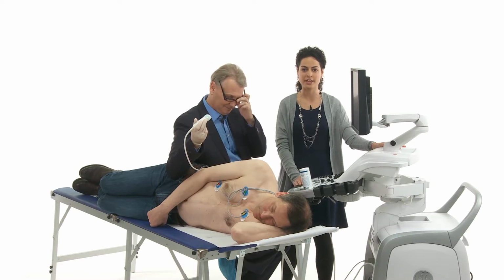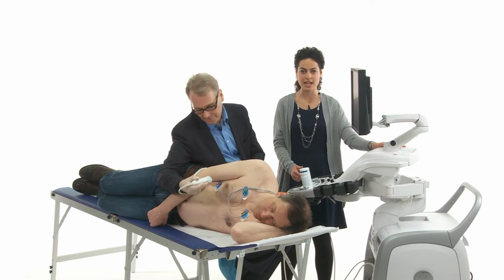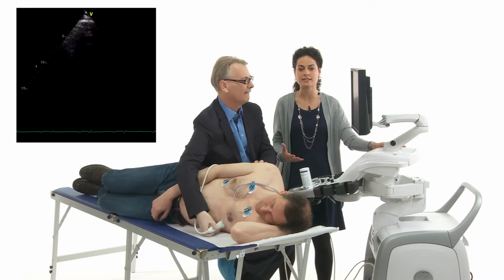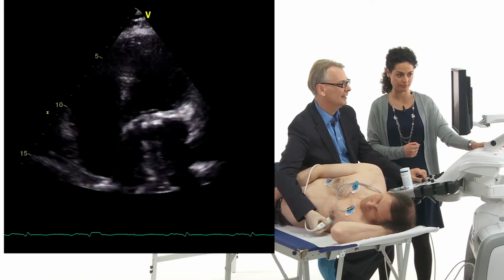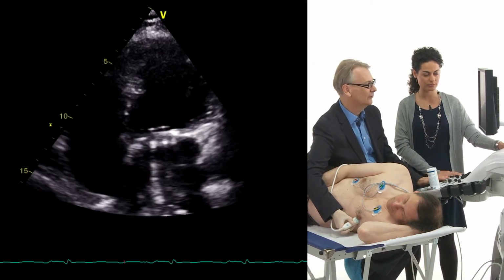Our patient was operated 14 years ago because of flail leaflets of the mitral valve, and now he has this mechanical prosthesis, and we want to assess the function. He's doing really well, but still we need regular follow-ups. Exactly. So the first thing we do is we look at the color Doppler looking for regurgitation.